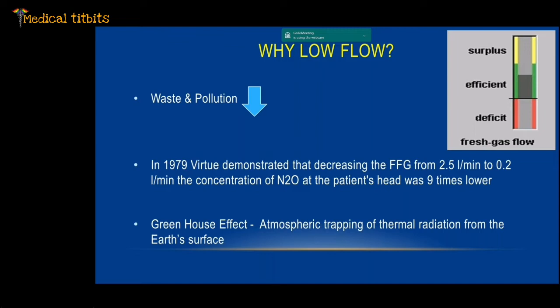I mean, in today's times when we have the COVID virus, that's what I was telling you. Everybody's talking about the incubation boxes. People are talking about positive pressure OTs, negative pressure OTs, the changes of air, the laminar flows, and so on and so forth. Everything has been discussed, but hardly anybody is talking about reducing the flows.